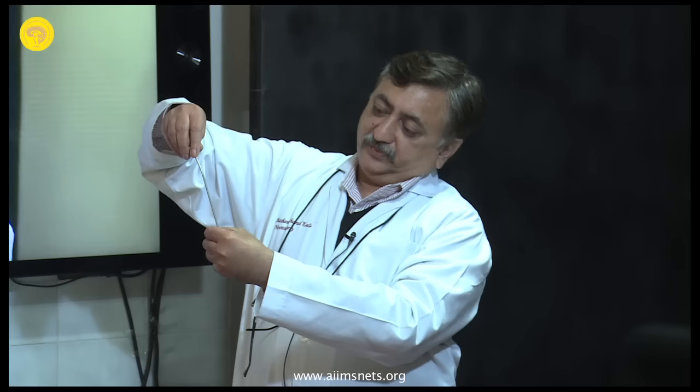And as you know, the ends of any construct take the maximum load. So your S1 screw is going to take the whole end load of any construct which you use. So your S1 screw has to be the biggest and the largest and the longest of all the screws which you can use. 6 mm, 6.5 mm, 7 mm if your pedicle is big enough. Hit the promontory. You must engage it to the promontory so that you get a bicortical purchase here, because your construct ends at S1 usually.